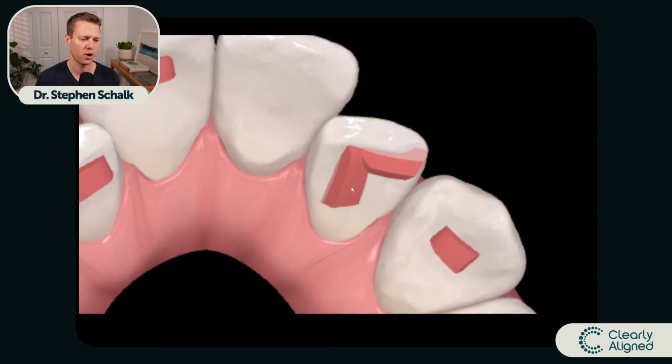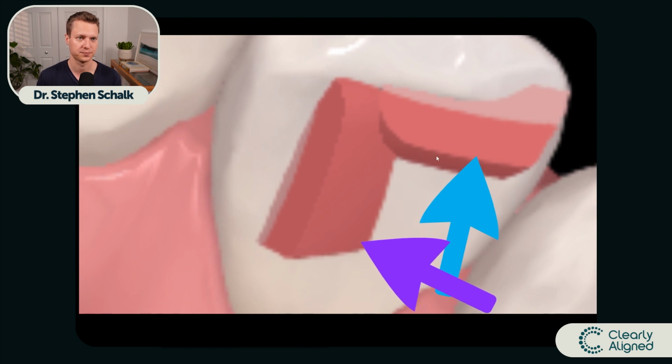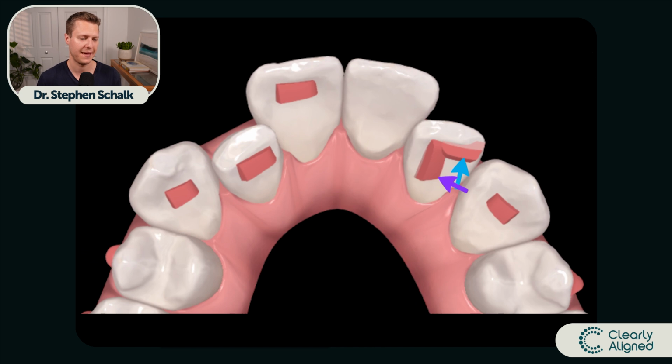So we'd be pushing with one finger on this surface of the attachment, and on the other surface, on the gingival surface, we'd push underneath on this shaded surface right here. So that's how we're going to rotate the tooth, but also extrude the tooth. And this attachment I learned from Dr. Christian Fournier in Montreal, and he likes to call it his hockey stick.